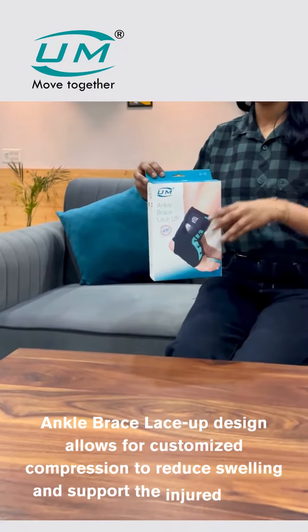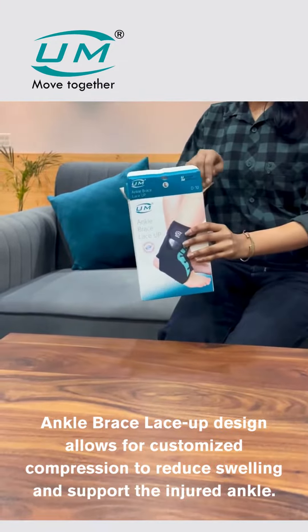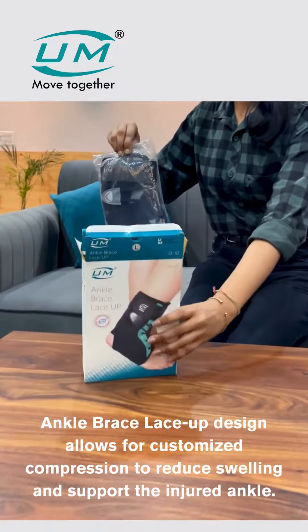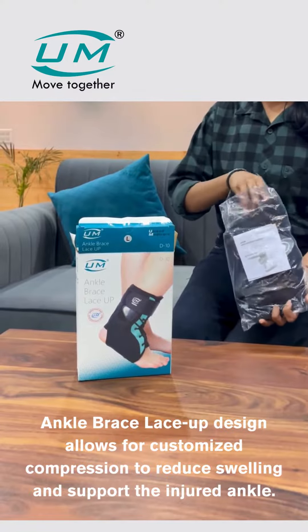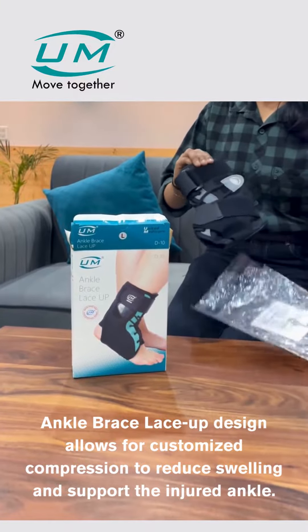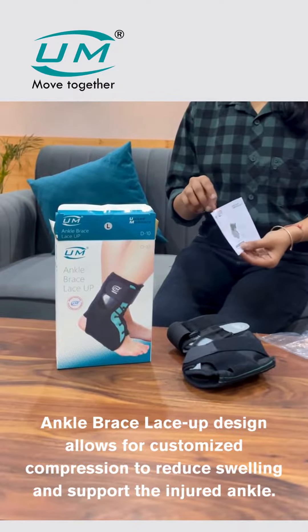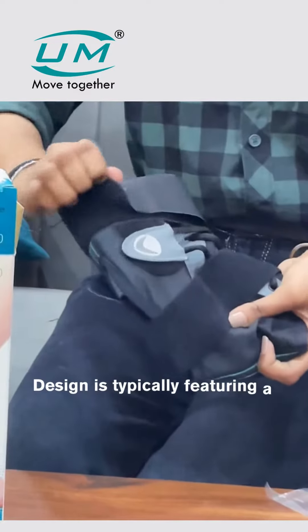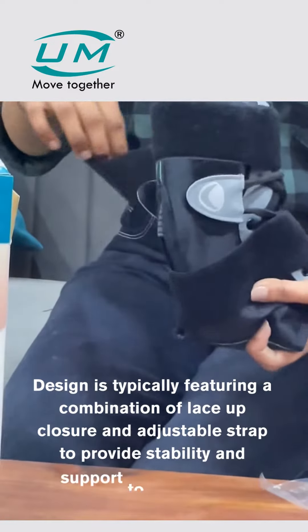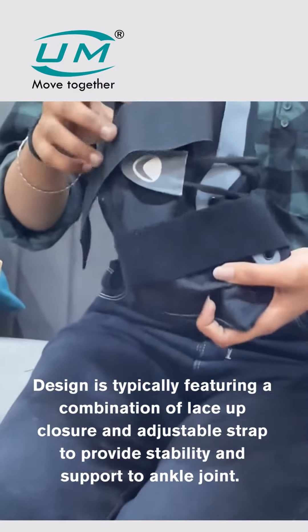The ankle brace lace-up design allows for customized compression to reduce swelling and support the injured ankle. It features a combination of lace-up closure and adjustable straps to provide stability and support to the ankle joint.